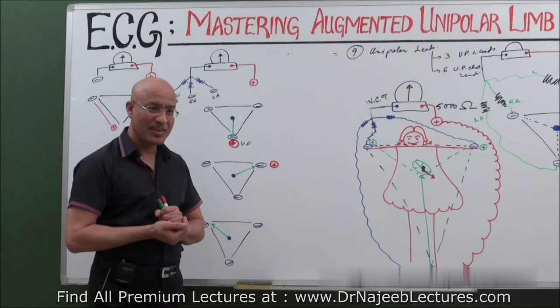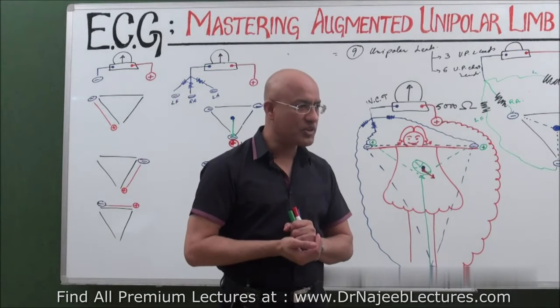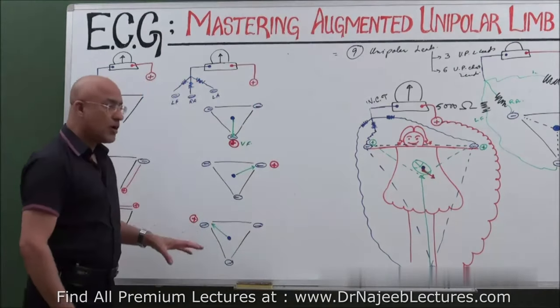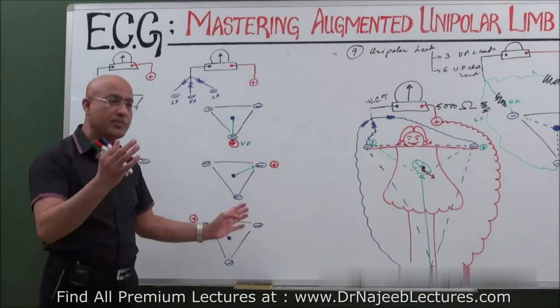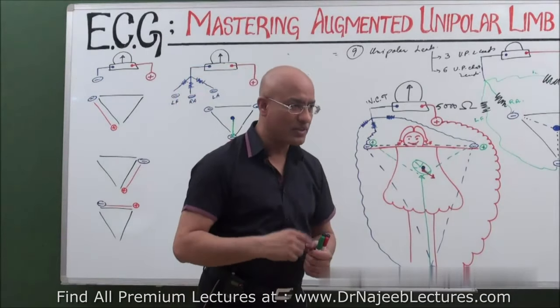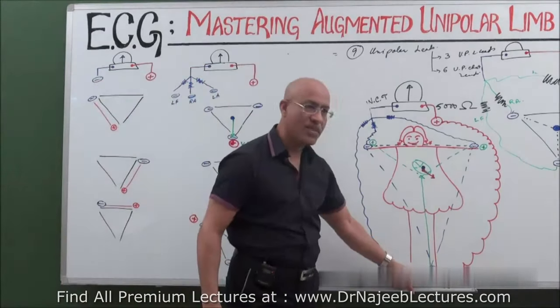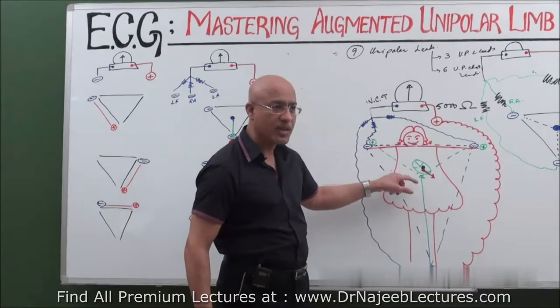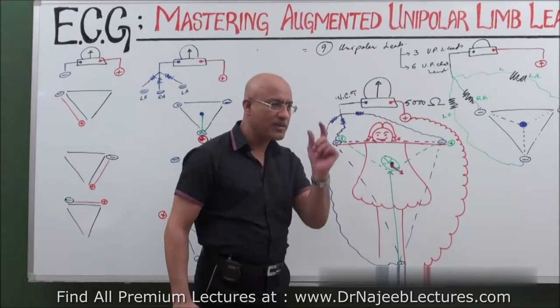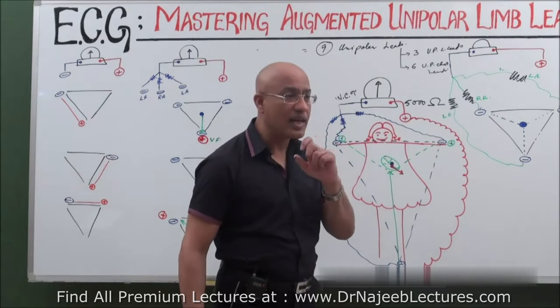Isn't it strange? In the 1940s, another doctor came, a cardiologist, and his friends, Mr. Goldberger. They were looking at how the voltage picked up by the unipolar leads made by Wilson should somehow be augmented, amplified. So they started working on that. How can they do that? If you look through the Wilson system, you are understanding? The problem was that even though the view was perfect, the voltage was very less.